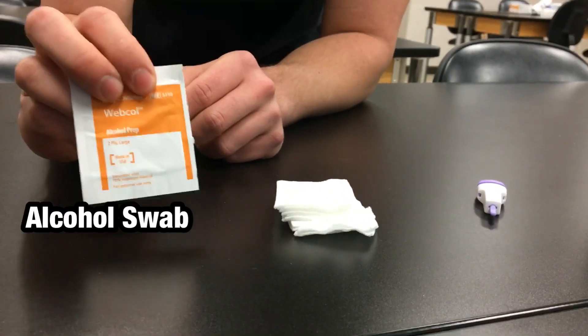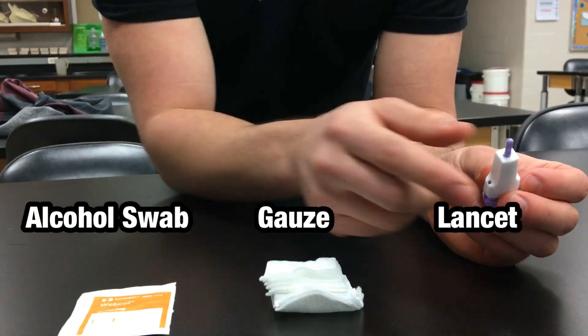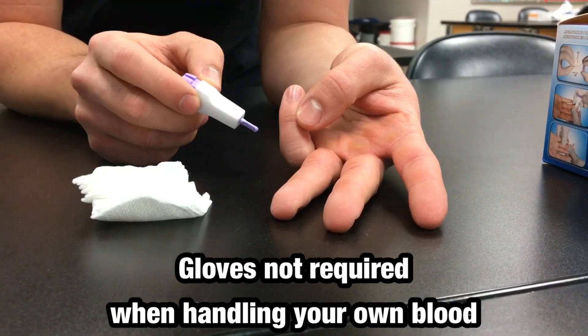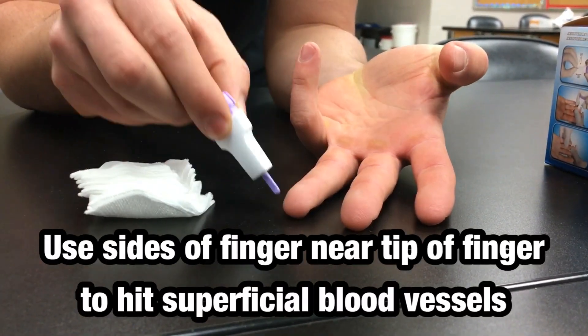Things we're going to need: we have our alcohol prep pads, we have some gauze, and we have our lancet. I'm going to show you first where we're going to prick the finger, and then we'll go through the process. We're going to use one of these three fingers, and we want to prick the side of the fingers as we'll get easier blood flow.